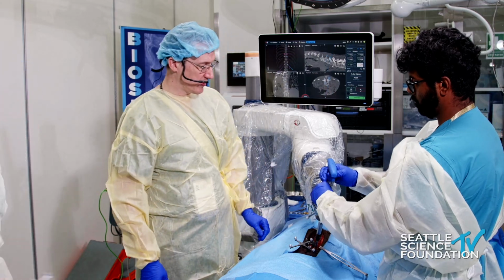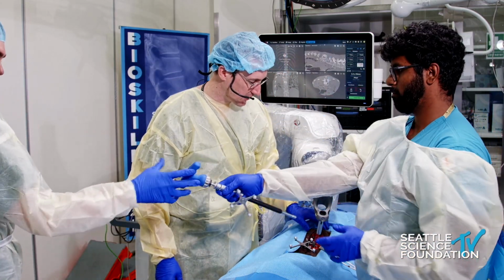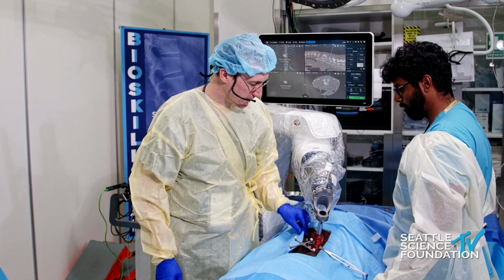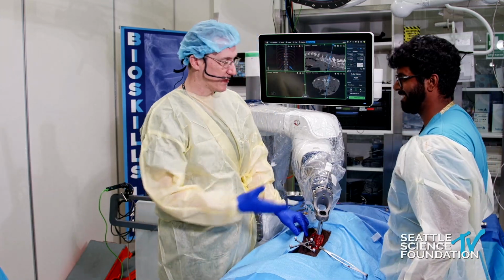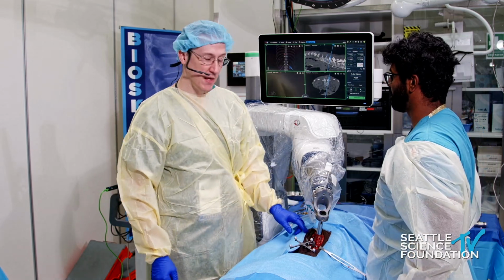Well, Dr. Rao, excellent job. I see 4 perfectly placed screws here on his side. And of course, mine pale in comparison. Congratulations, nice job. And best of luck to you on your fellowship.